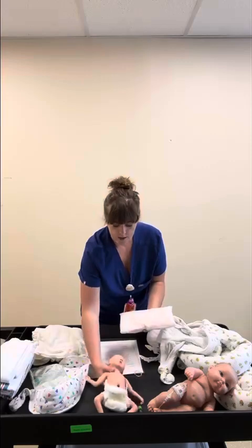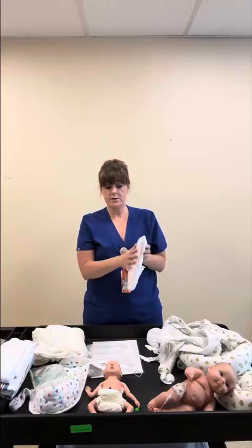So you might say, well, this looks huge. My baby is super tiny. How do I do that? So there's a couple ways. You don't have to use this whole device. You can just use the bottom half.